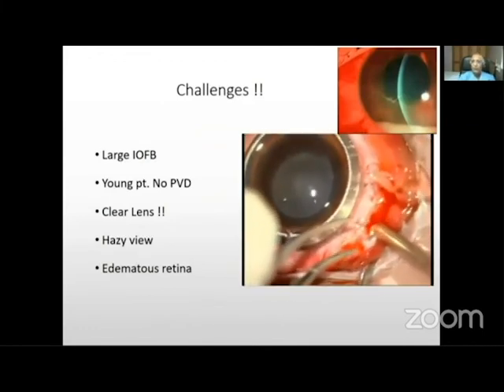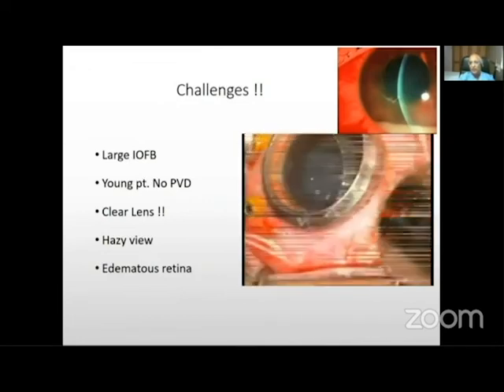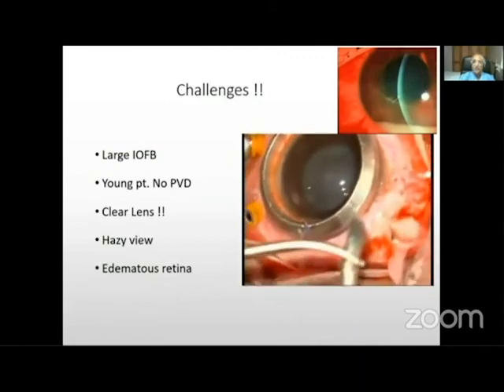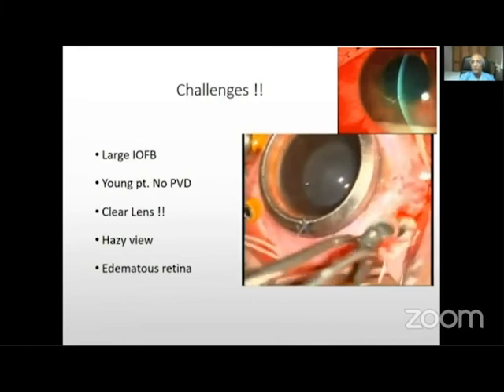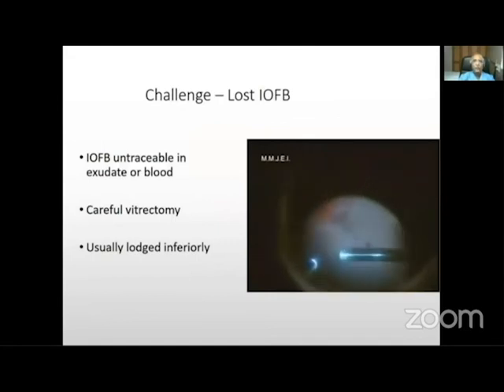this video. The foreign body comes out easily with a limited vitrectomy after freeing it from the rest of the vitreous. And once this is done, a second surgery can be performed later when the inflammation is down, and the vitreous can be cleared of all the vitreous debris, where it amounts to just an optical vitrectomy. So a two-stage surgery is also prudent.